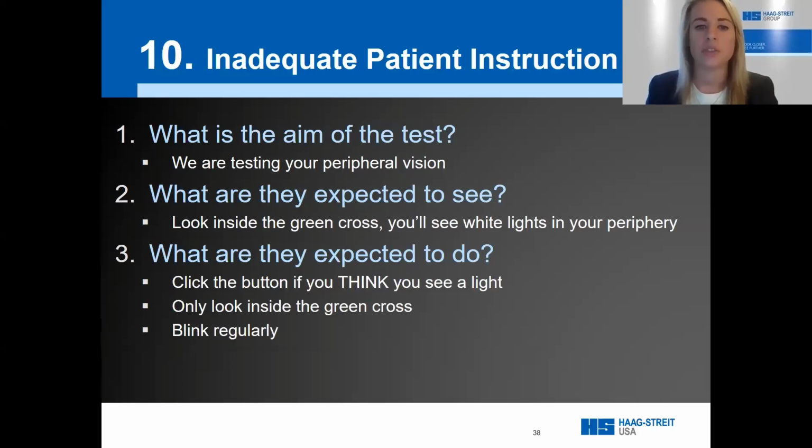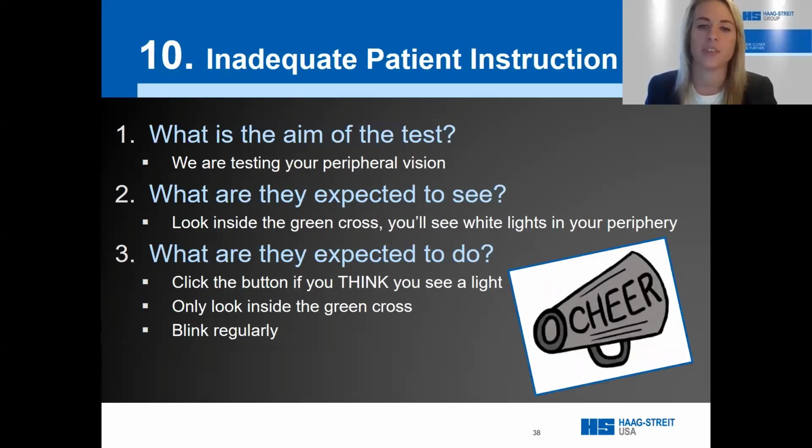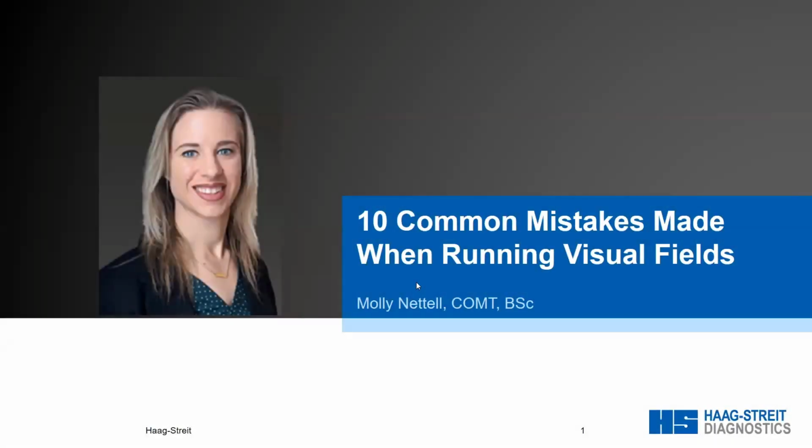By explaining each of these points, you are easing the patient's mind. Some patients come into the room thinking the field is a pass or fail test. Those are going to be your trigger happy patients, high false positives, and an unreliable field. We need to reassure our patients that this is not a test and ensure they understand what to do. I always think of visual field techs as cheerleaders. We're there to cheer our patients on throughout the entire field to ensure their confidence is high to get the best results.